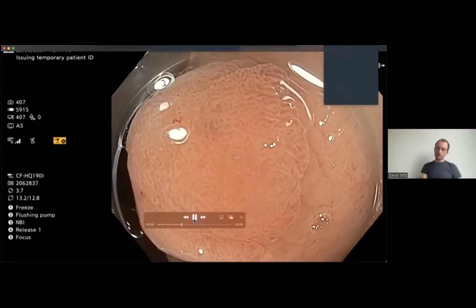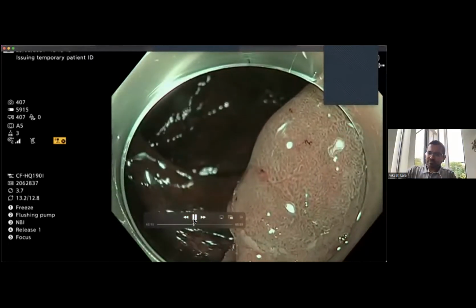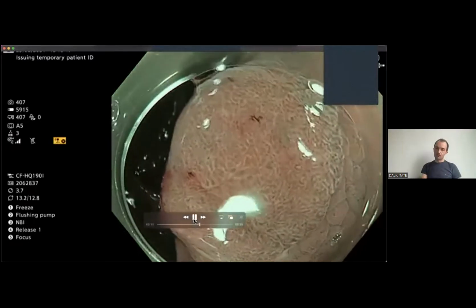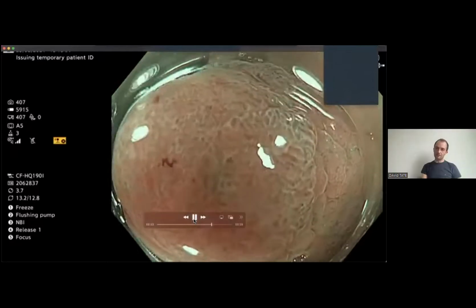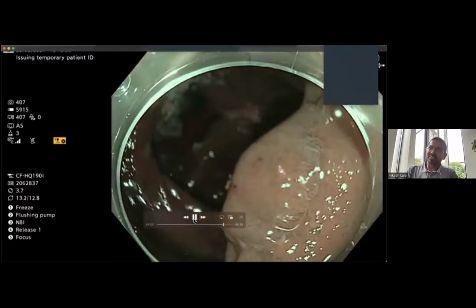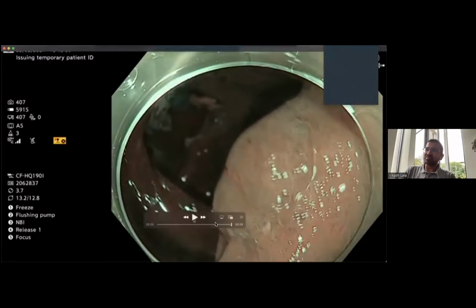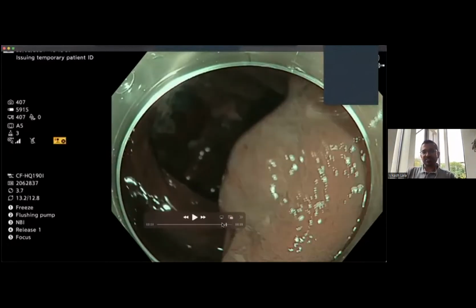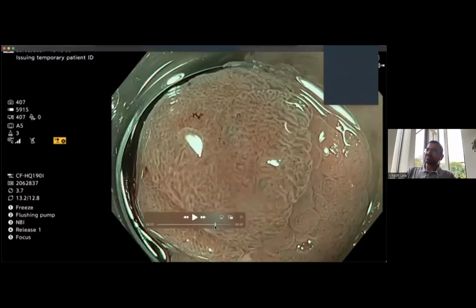So you said a load of very important things there, Vikash. But are they easy to interpret, the things you said there? You said it was non-granular, didn't you? So it can be quite challenging, especially the granularity. And I think David has done some work showing that that's the most challenging part for endoscopists to determine, whether it's granular or non-granular. But I think in these very small lesions, it might be less relevant, but certainly something that you want to look at.